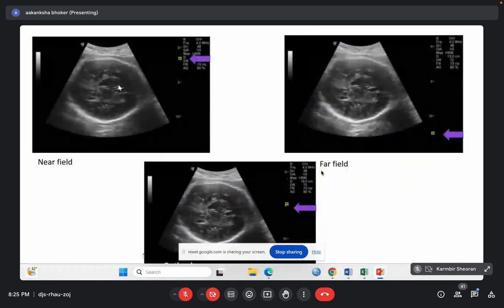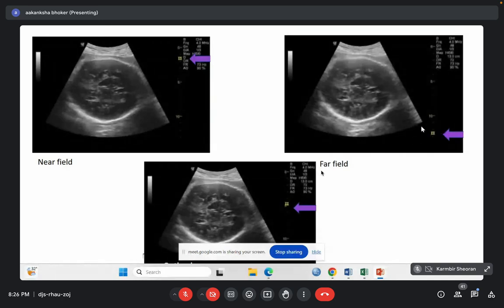अभी देखो ये यही दिखा रहा है कि नियर फील्ड के अंदर रखा तो यहाँ पे रिजोल्यूशन है, इधर रिजोल्यूशन नहीं है। इसमें क्या किया, बिल्कुल ही नीचे ले आए तो फिर से PRF कम हो गया। हमने सोचा कि रिजोल्यूशन तो बढ़ा देंगे पर PRF कम होने की वजह से इमेज क्वालिटी खराब हो गई है। But here when we have kept it at the region of interest, the image appears with good detail.